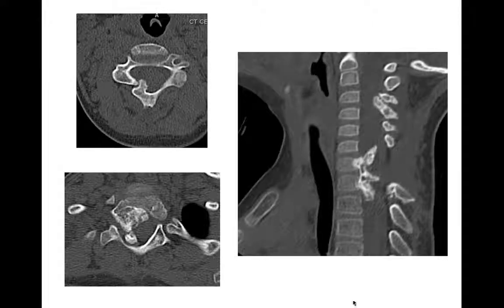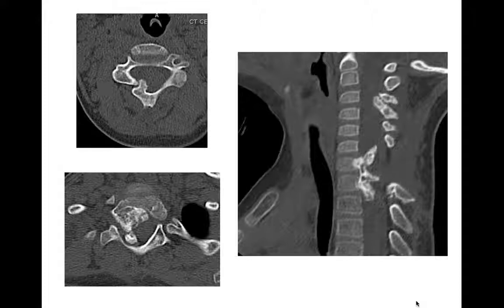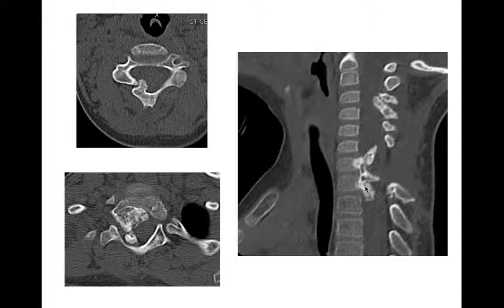Just to show that osteochondromas can occur in the spine and vertebral bodies as well — a bad place for one. Here you see an exostosis in continuity with the marrow and cortex extending into the vertebral canal. It's quite extensive on the sagittal plane, and you can imagine the cord is not happy — it's shifted. This was a child with multiple hereditary exostosis who had neurological symptoms. Not a common place for osteochondromas, but they can occur there.